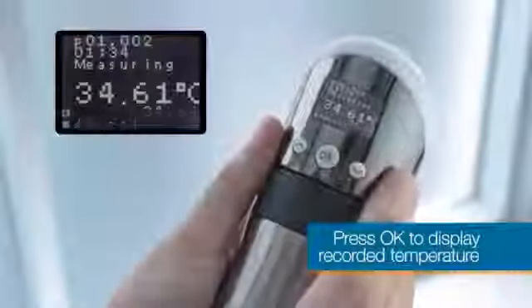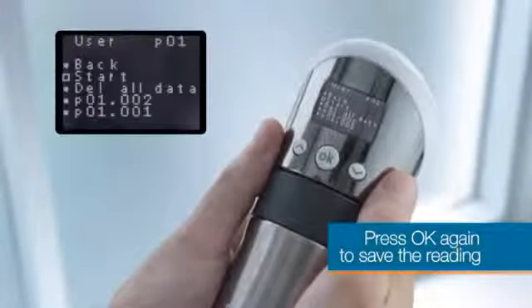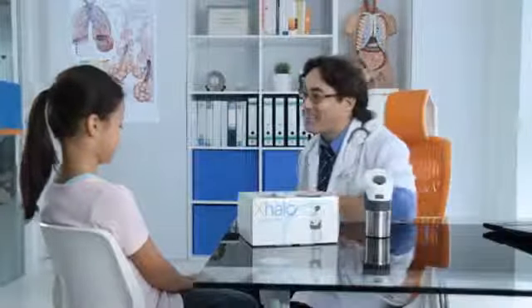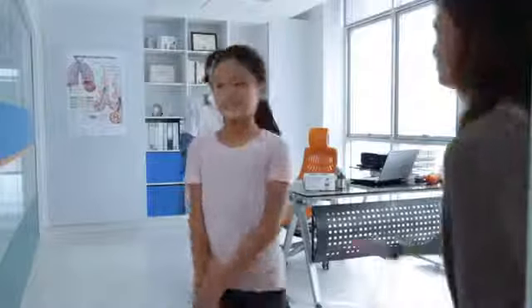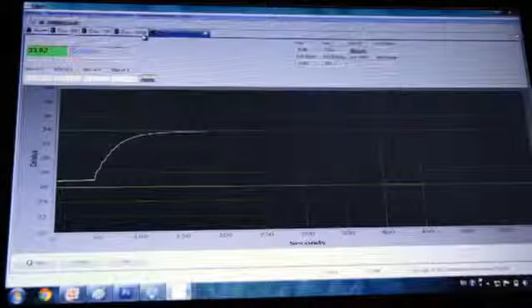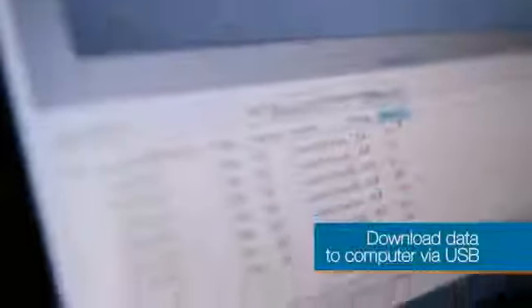To display the recorded temperature, simply push the OK button, and once more to save the reading. At the end of each session, the data recorded by the exhaler can be downloaded onto a computer, where you can access the data for trend analysis, comparisons, and to print the results.